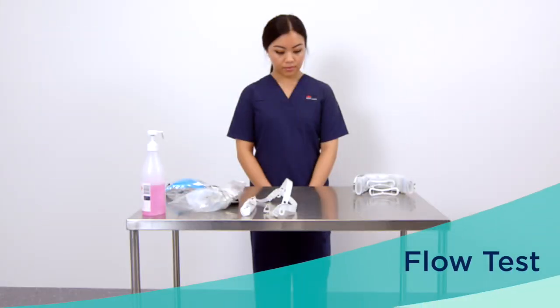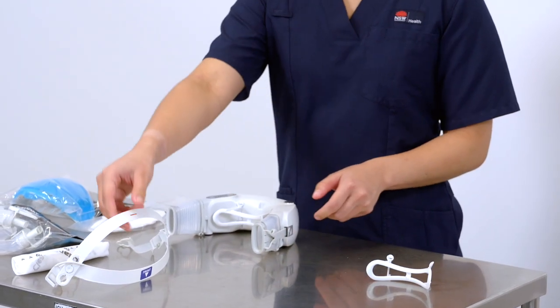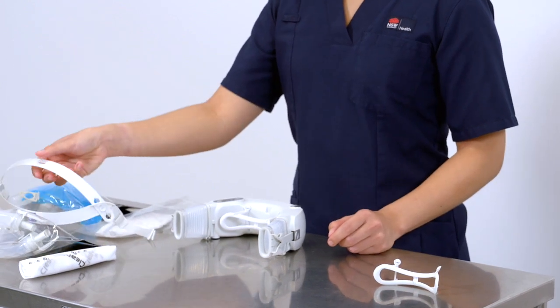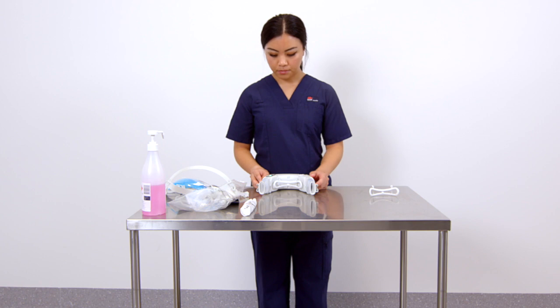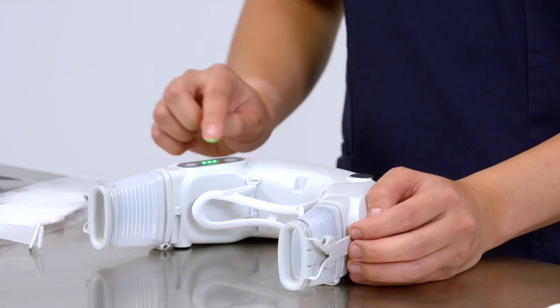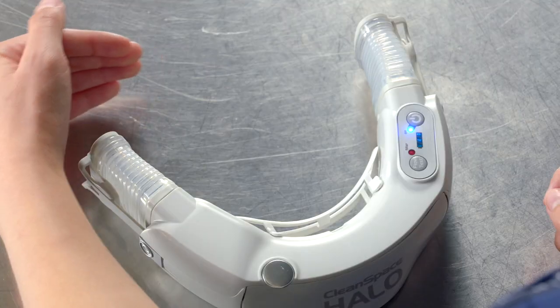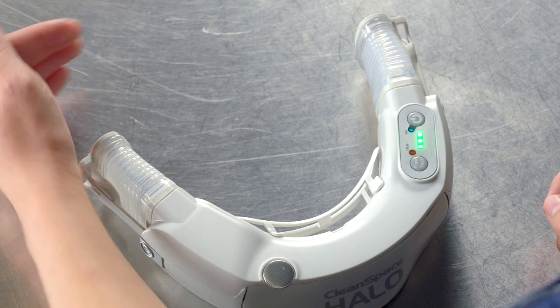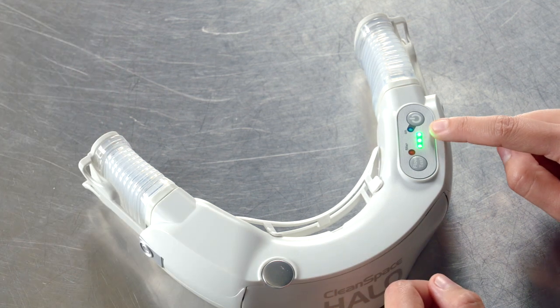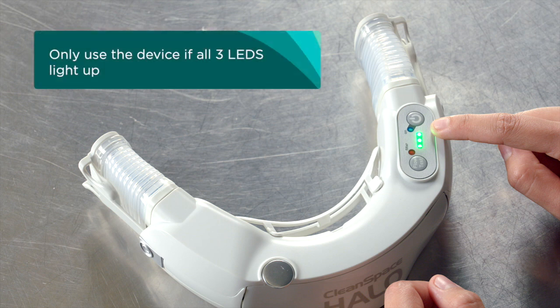Perform a flow test if required by your facility. Place the respirator flat on a table or surface, ensure it is in standby mode and that the mask is not connected. Press and release the button marked flow test. The motor will run fast and air will be discharged from the active arm of the bellows. After two seconds, the respirator reports the result using the LEDs on the keypad. Only use the device if all three LEDs light up.